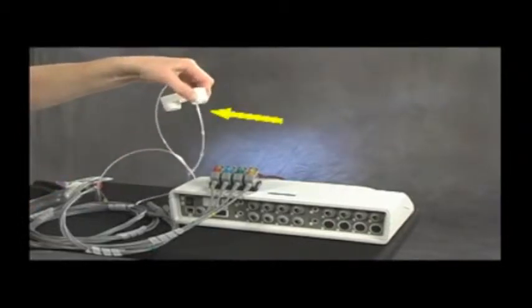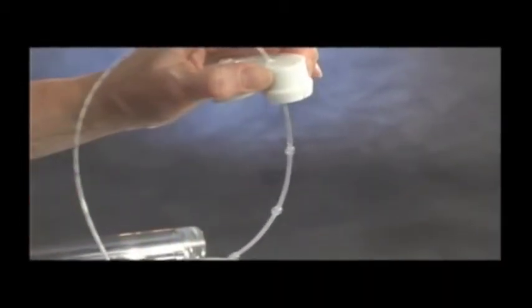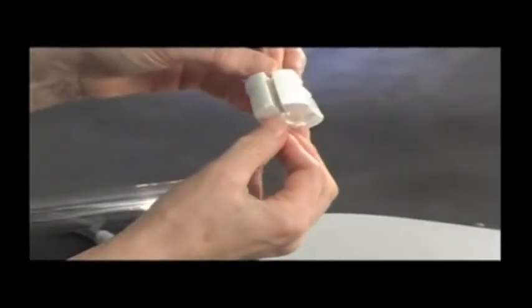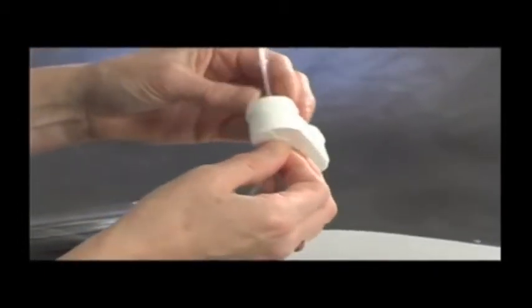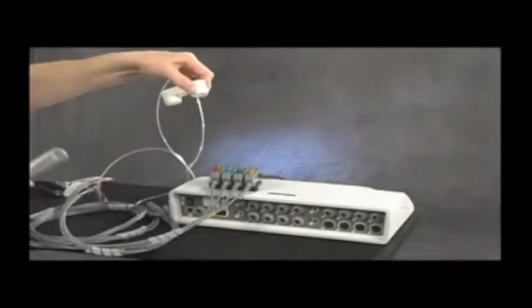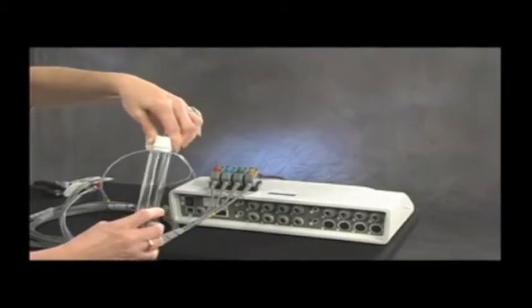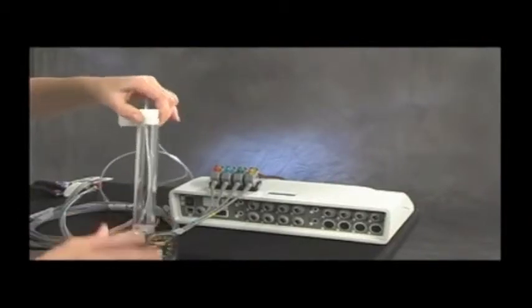The catheter should be positioned so that the silicone cap is several centimeters from the proximal balloon sensor. Next, enfold the cap around the catheter so that the lengthwise slit is completely closed. It may be necessary to tug gently on both ends of the catheter protruding from the cap to ensure it is seated properly for an airtight fit. Next, insert the catheter tip into the calibration chamber and fit the silicone plug snugly into the opening of the chamber to ensure an airtight seal.